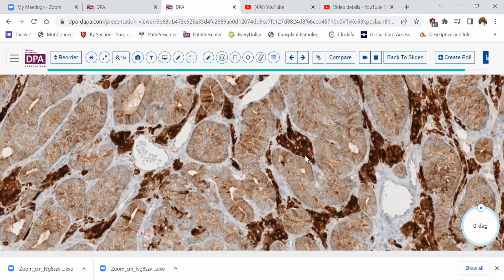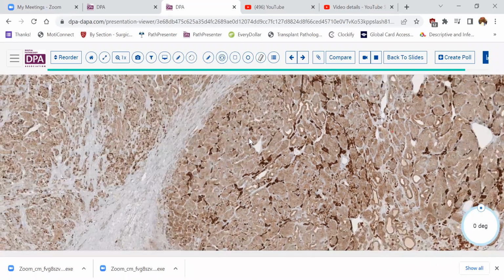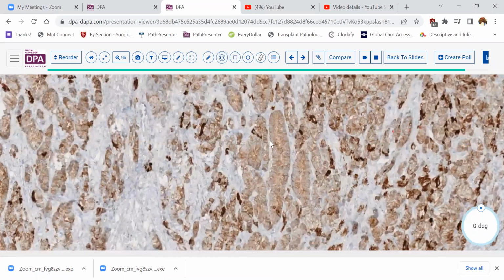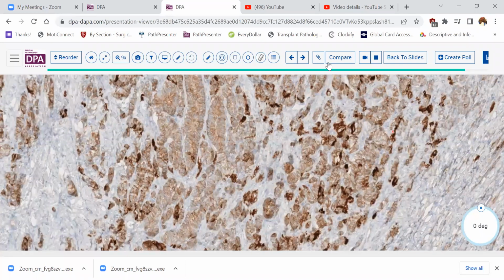which may at times be diagnostically useful, and particularly if you're searching for less frequently identifiable Leydig cells, using this to identify the Leydig component of these tumors might prove useful. Say if you had an area like this, less obvious cells, these more darkly and intensely staining inhibin positive cells could be a reasonable surrogate for the crystalloids, which we saw earlier on the H&E.